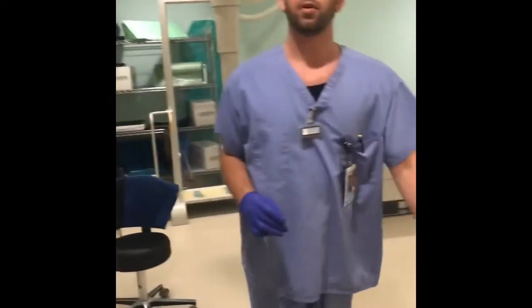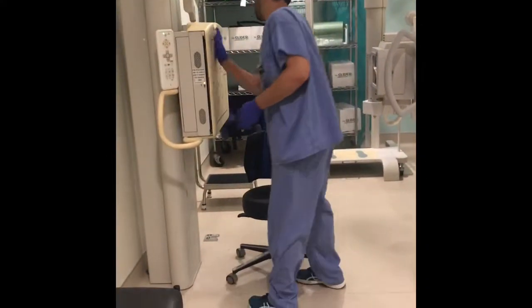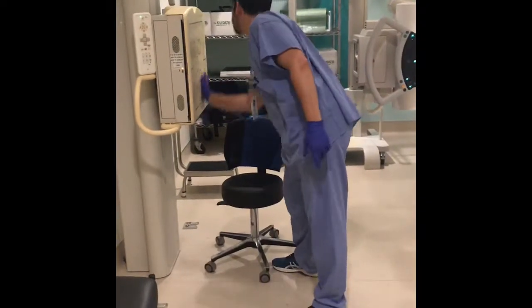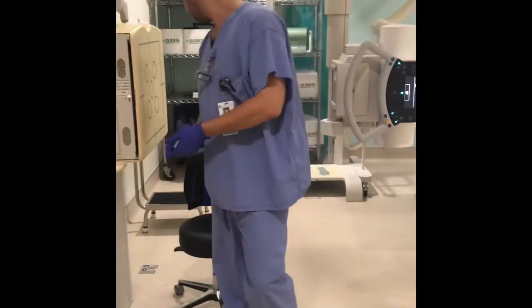So, before I get started, I'm going to clean off my bucky. When your patient's face is especially coming in contact with anything, you want to make sure it's clean for them.